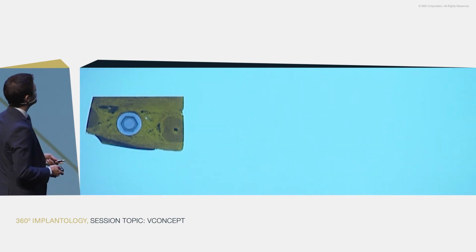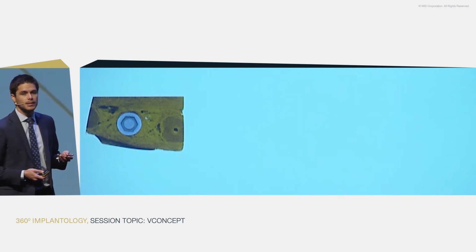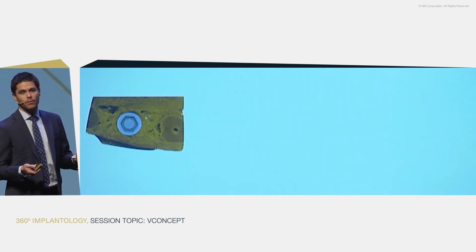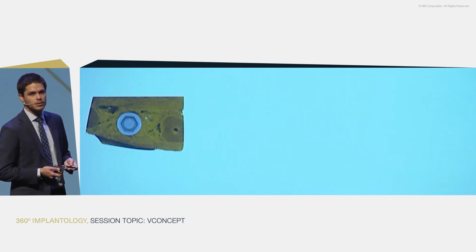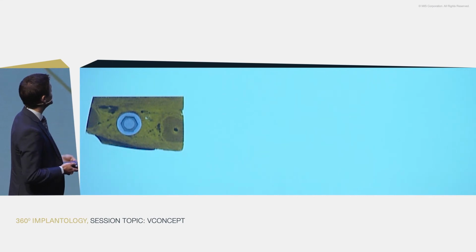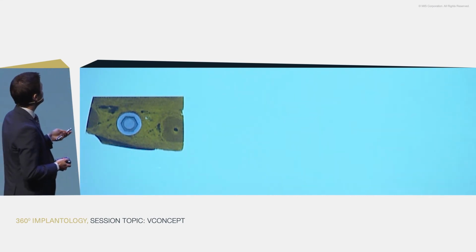So today, as I wanted to share with you, we do have the opportunity of checking with this type of images. These are micro-CTs. And micro-CTs are a way of evaluating sections. This is a non-invasive way of evaluating the histological sections where we have very high exposure and very high detail. You can appreciate here the dentinal tubules.